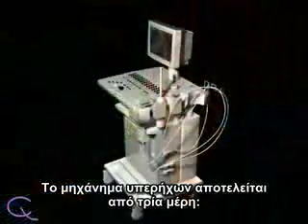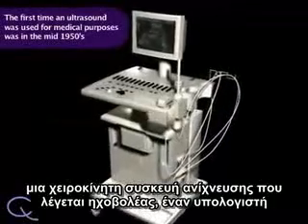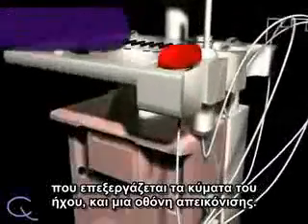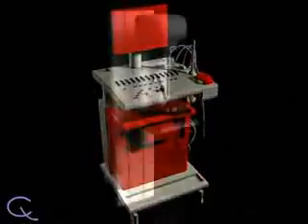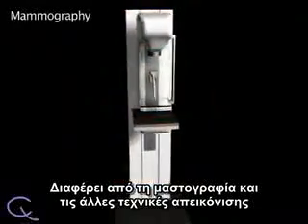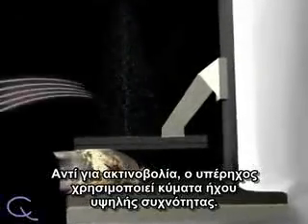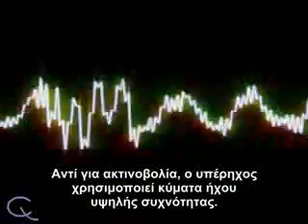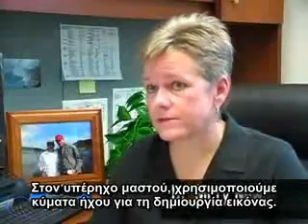The ultrasound machine consists of three main parts: a handheld detection device known as a transducer, a computer that processes the sound waves, and a monitor that shows the images. It is different from mammography and other imaging techniques that use X-rays to create an image. Instead of X-rays, ultrasound uses high-frequency sound waves. With breast ultrasound, we're using sound waves to construct the picture.